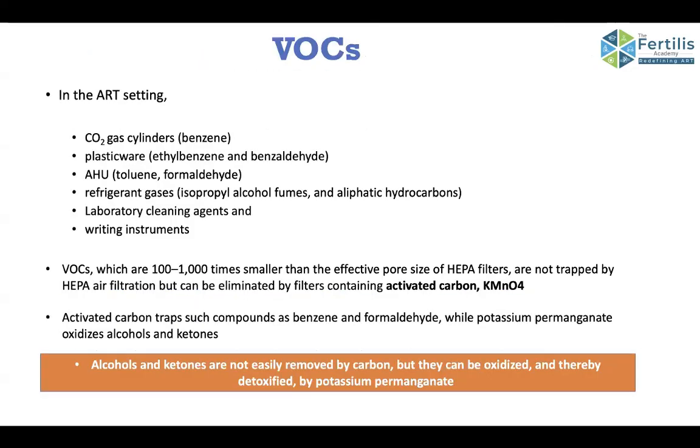Another invisible enemy for all embryologists and clinicians is the VOCs. In the ART setting, the most common source of VOC is CO2 gas cylinders, especially since CO2 is a liquid gas.